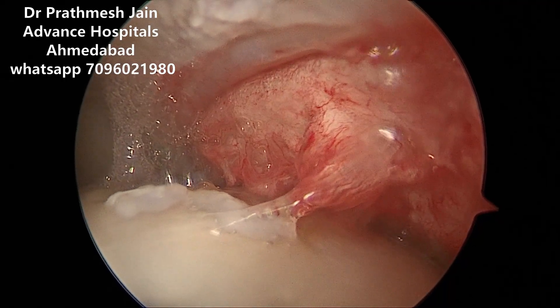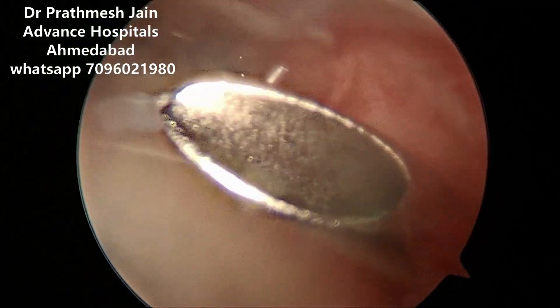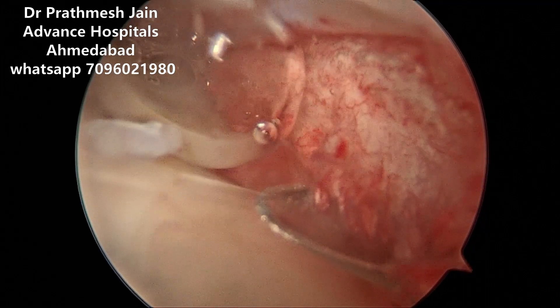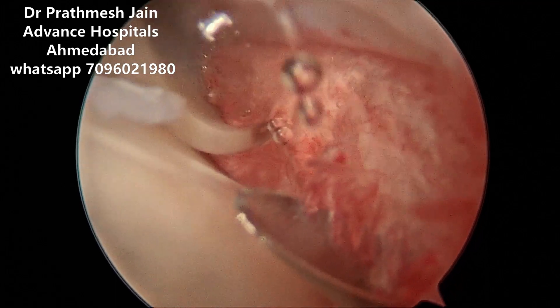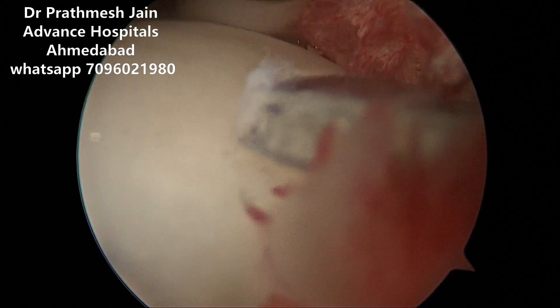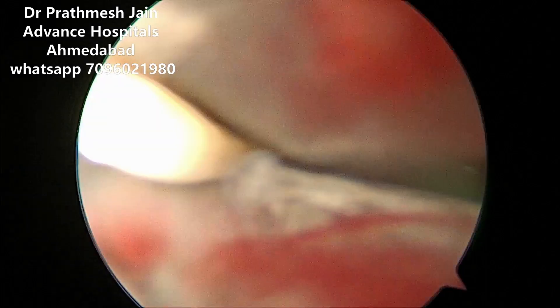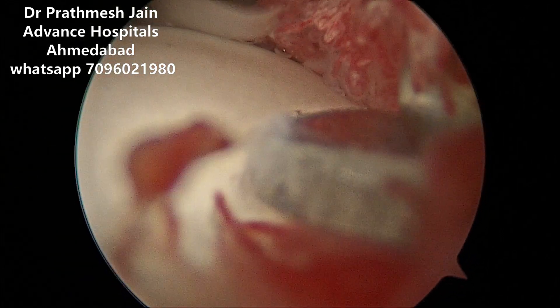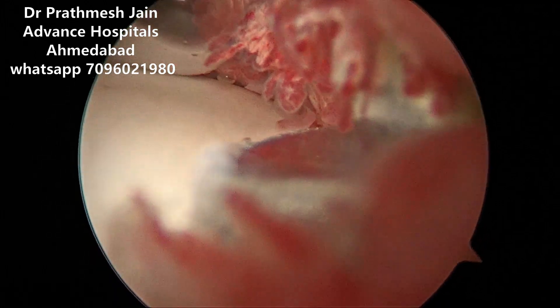Here we are demonstrating a live arthroscopic surgery. We can appreciate that we are making an anterior portal viewing by an anterolateral portal. What you can appreciate here is an intense inflammation of the capsular tissue. We secure our portals by putting a half cannula, and then we will be releasing the capsule both anteriorly and laterally to make the movements of our instruments easy.